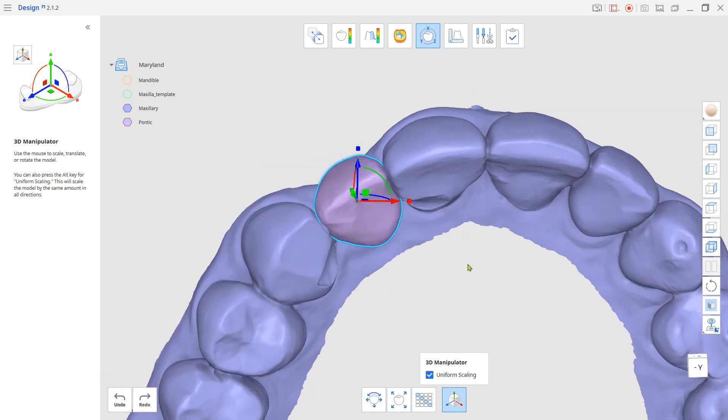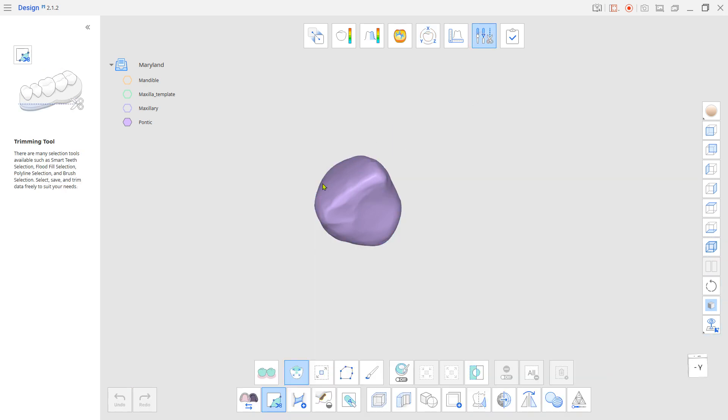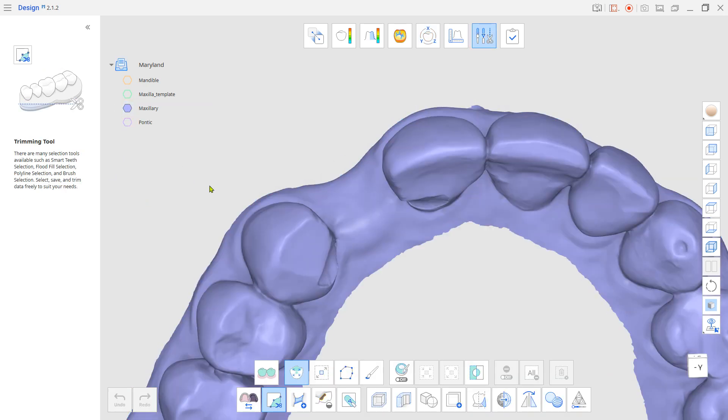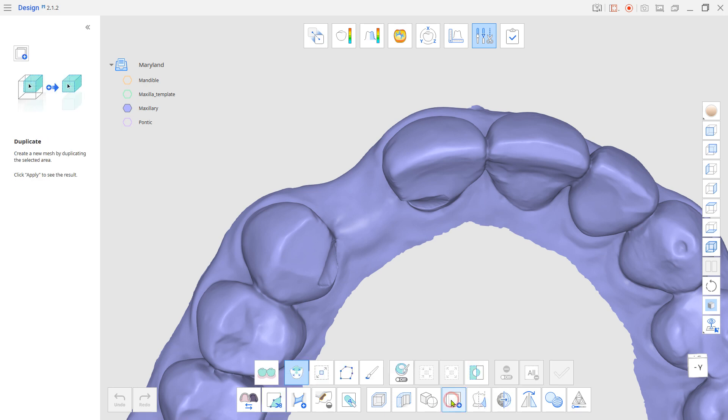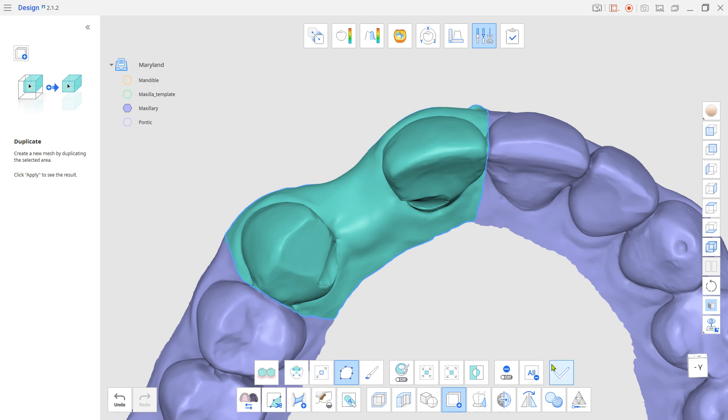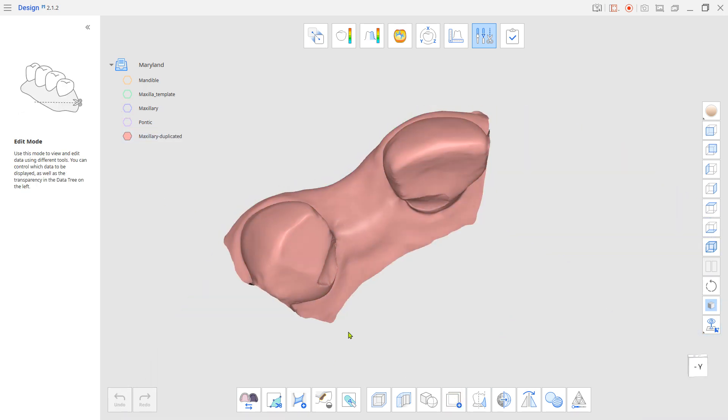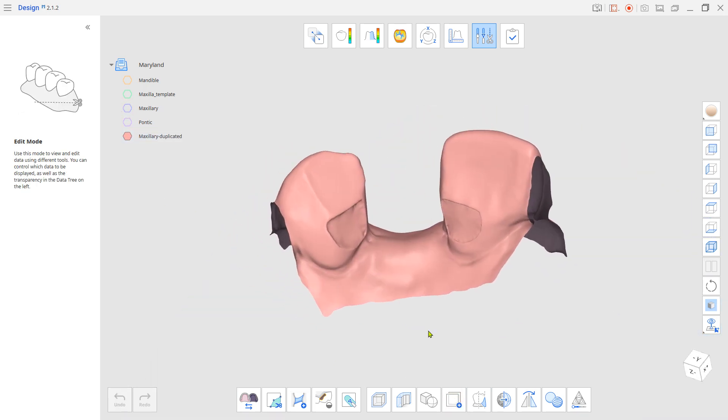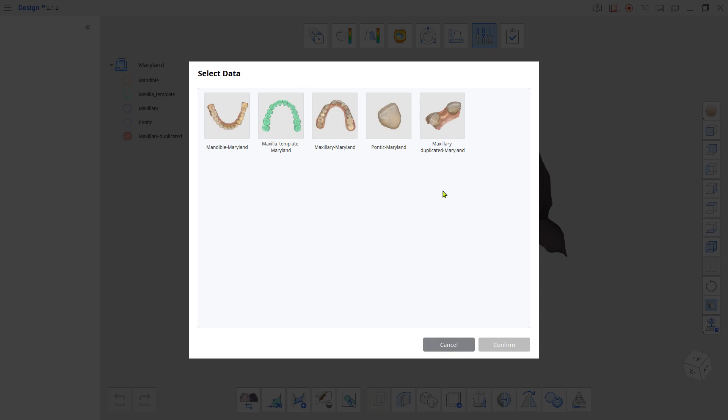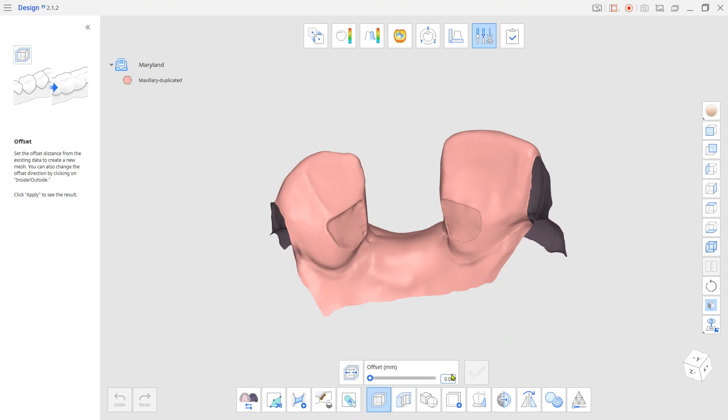Now we are going to make Wings. Go back to Edit Mode and duplicate the adjacent area from the original scan. Give a slight offset for the cement gap and duplicate the prepped area.